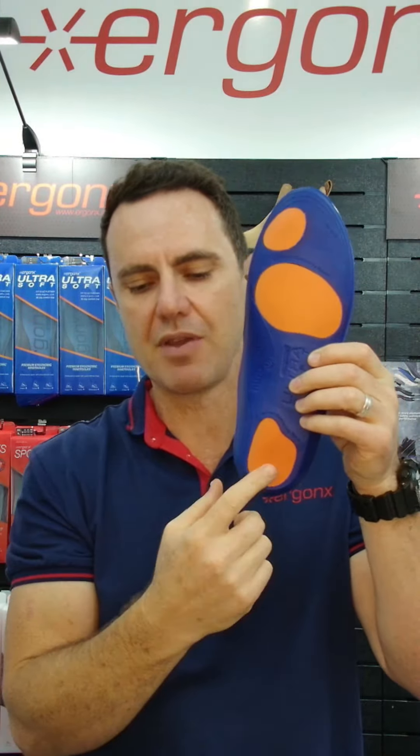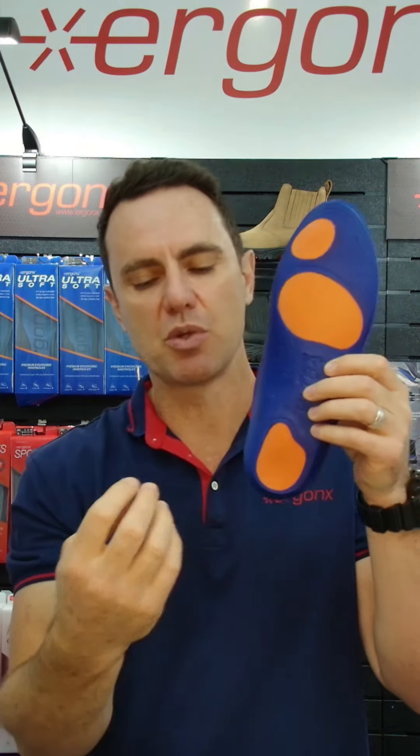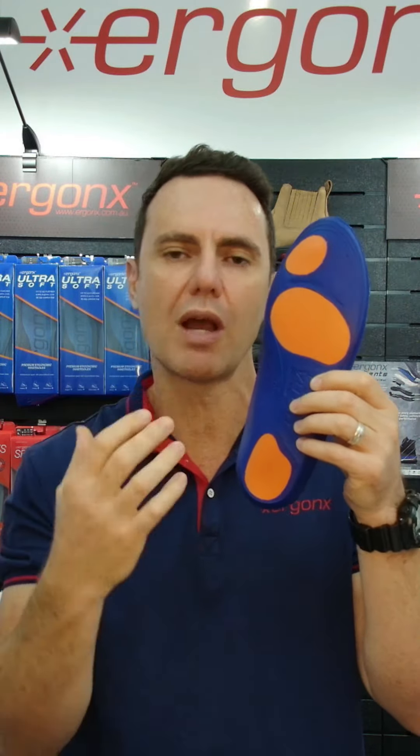The other thing we look for is whether it has heel and forefoot cushioning positions. This helps to rest the feet and make it more comfortable across the workday.